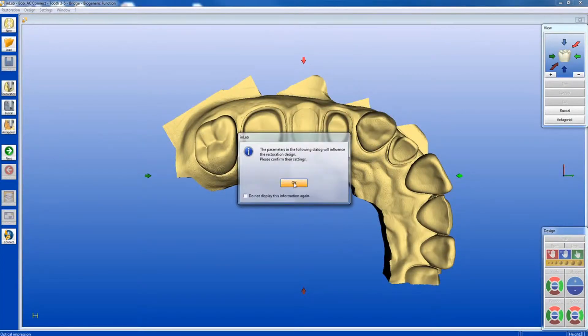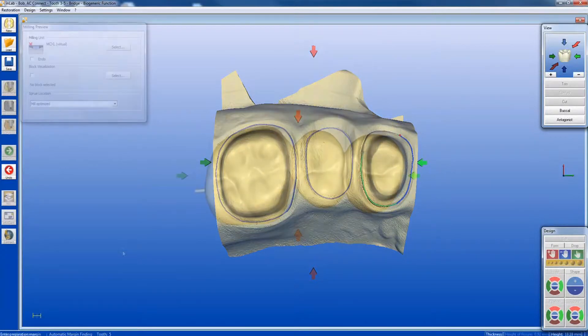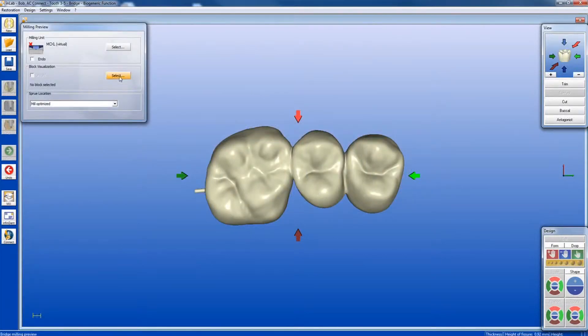Make any changes to your parameters at this time. Mark margins with the automatic margin finder. With your design complete, proceed to the milling preview.